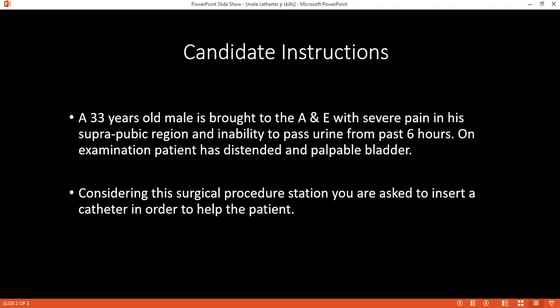If the patient has a betadine allergy or lignocaine allergy, what would you use instead? I would use chlorhexidine, alcohol based agents. Yes, alcohol based agents. Right, and we have done that adequately.